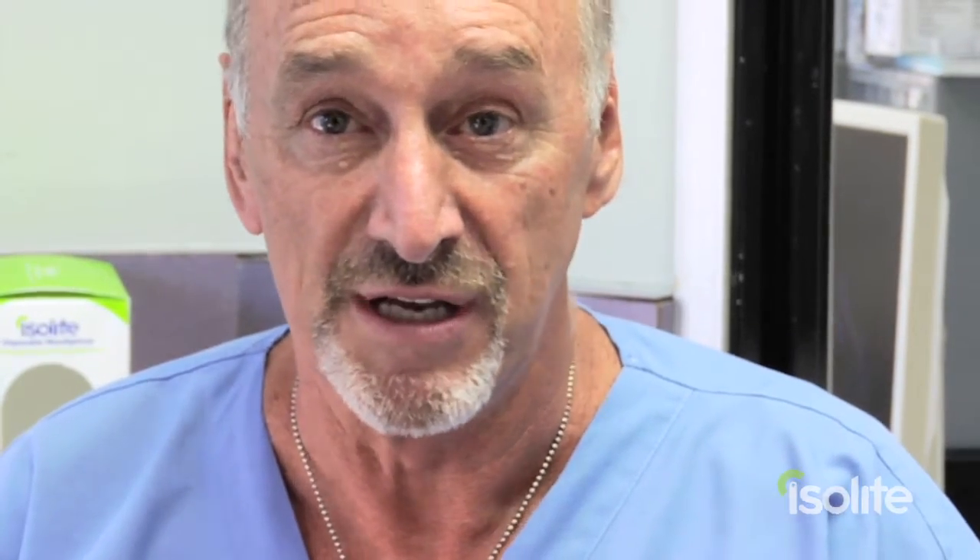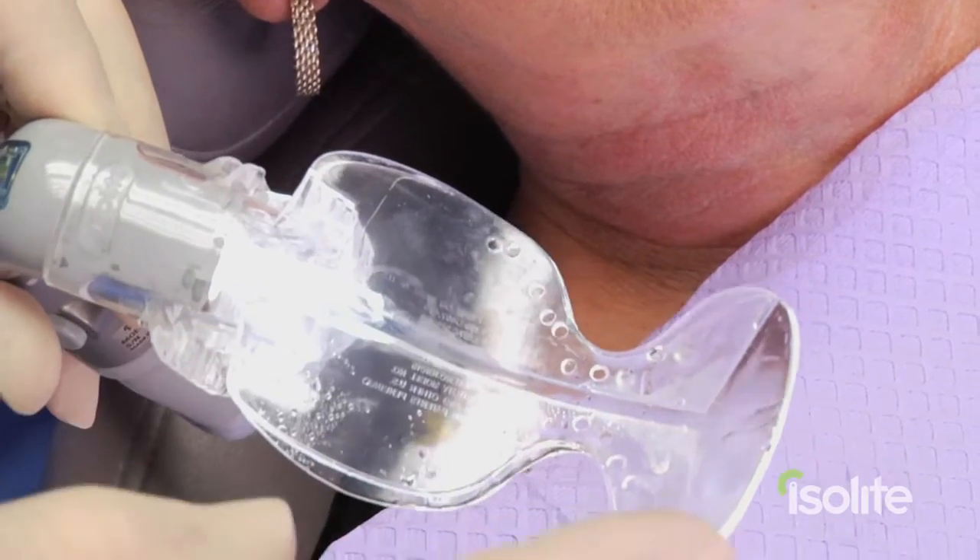It will vacuum up all of the water. Her tongue and cheek will be out of the way. I'm going to be supplying some additional cheek retraction because of the camera angles necessary to get this shot. So even though we have a retractor on her cheek, we really don't need it for this procedure. I've decided to utilize a medium DV mouthpiece.